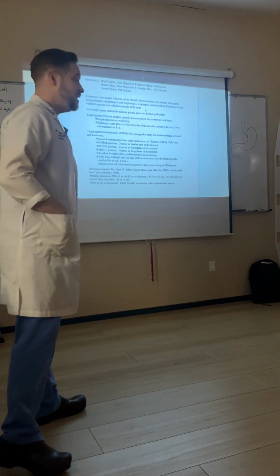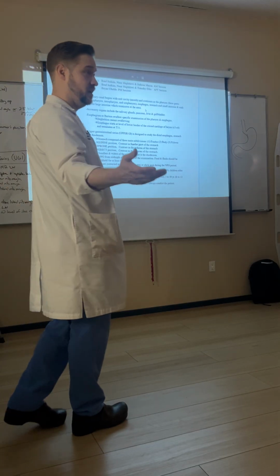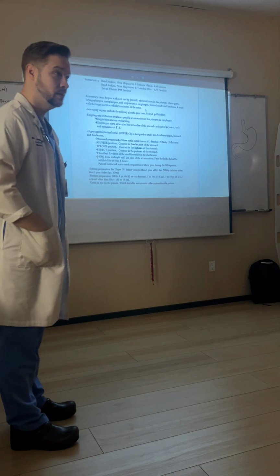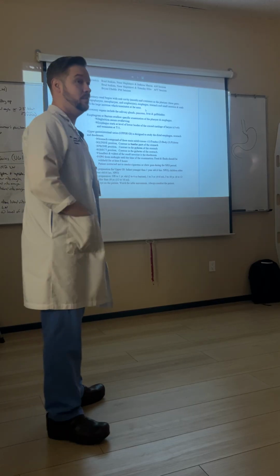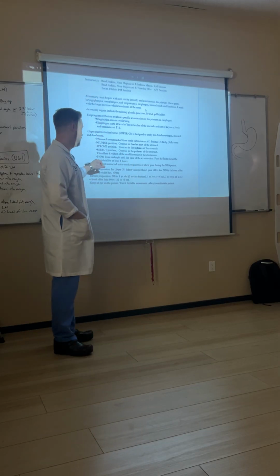For most adults, it's going to be NPO for 8 hours before the exam. Okay, so usually they'll have dinner and then nothing else after it until the next morning. We try to schedule fluoro exams early in the day, especially if patients have been NPO. Why? They're hungry. You want to really talk about a bad exam? A really hungry patient delayed for their upper GI exam. So food and fluids withheld for at least 8 hours.